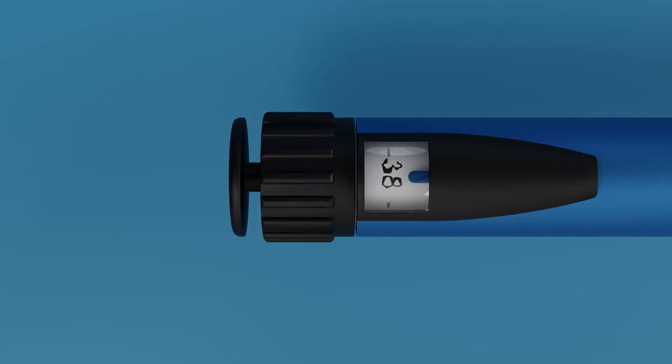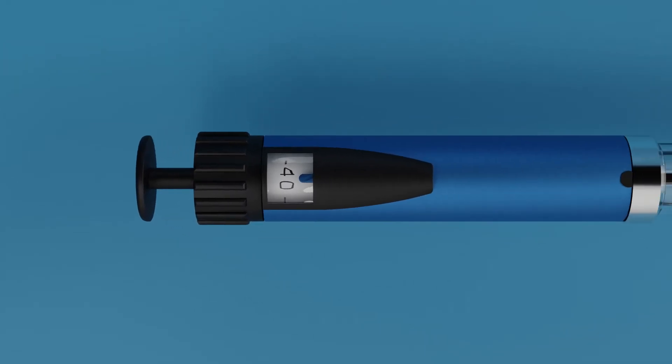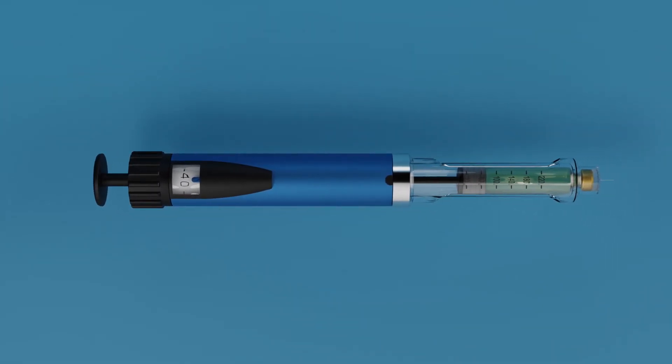Dial the required amount of Clotixa dose by rotating the dose dialer. The figure that appears in the dose dialer indicates the amount of Clotixa dialed by you. Like in this case, let us dial 40 mg.